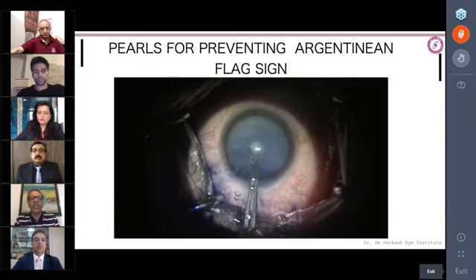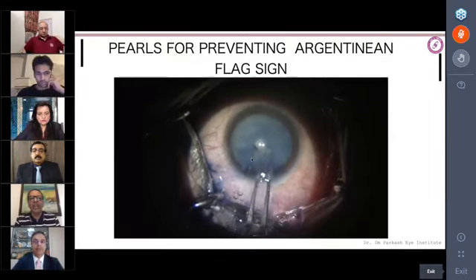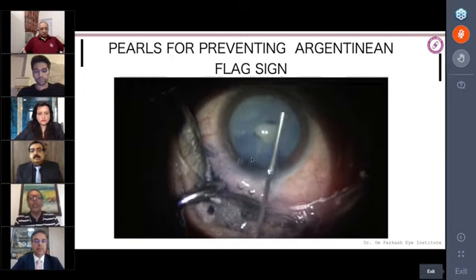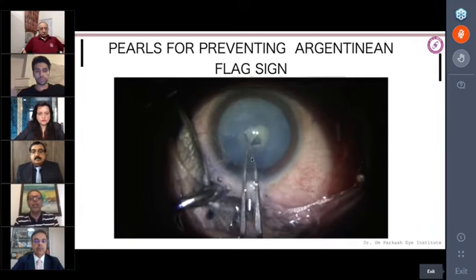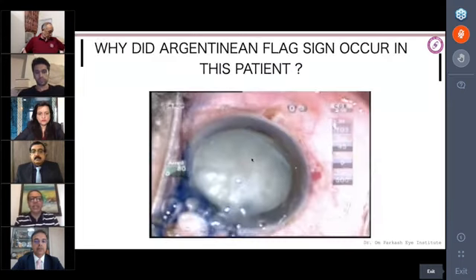Reverse anterior opening. It is trying to extend, but since it was directly under my view and my scope of controlling things, now where do we put the visco? You put the visco where I put, so that it doesn't extend, and then you can complete the rhexis in this intumescent cataract for that matter.